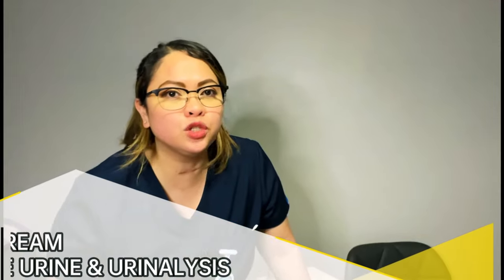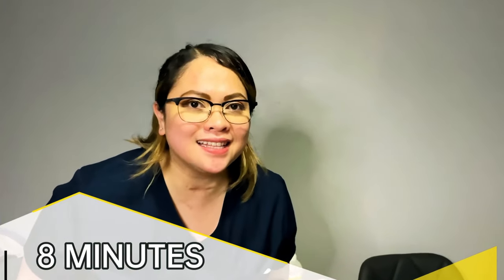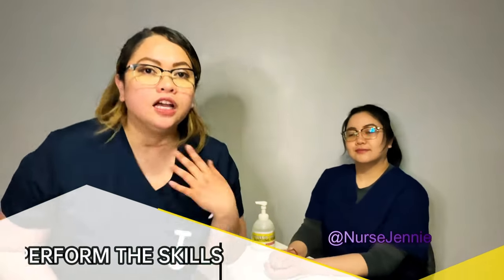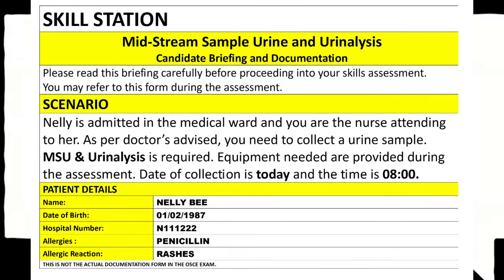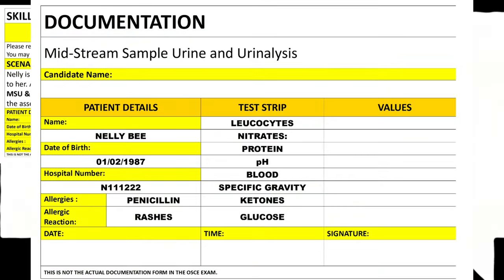MSU urinalysis is one of the skills for demonstration in the NMC OSCE exam. You have to do this station within 8 minutes. In this station, the examiner will tell you that the ID check and consent has been done. You just need to perform the skill. You will be given the scenario and the MSU and urinalysis form.